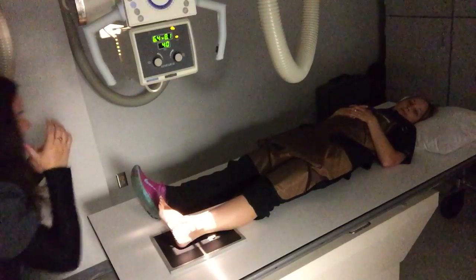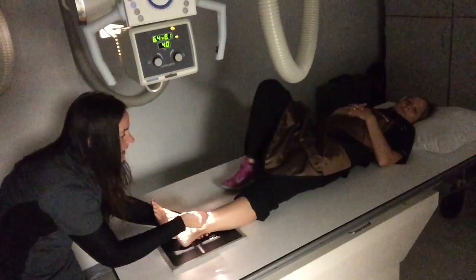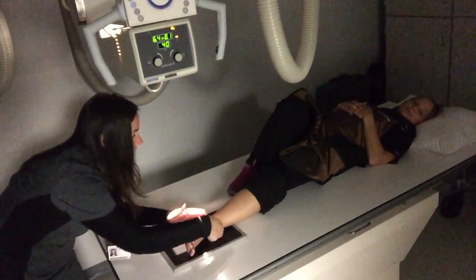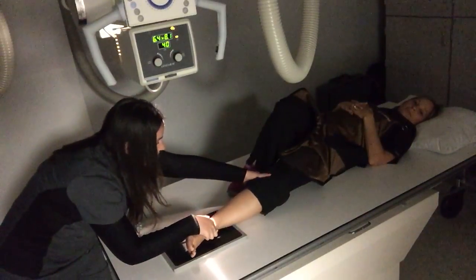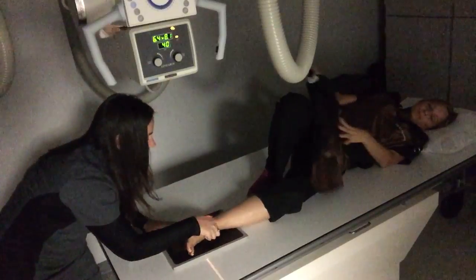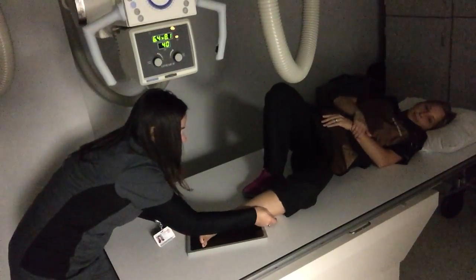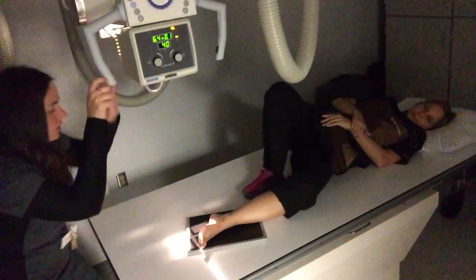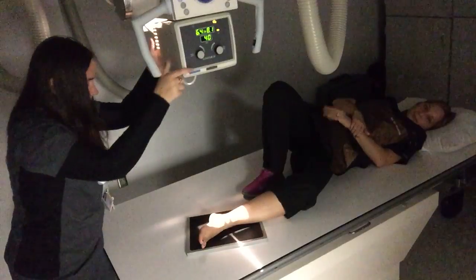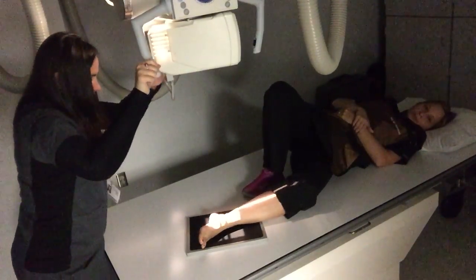And then the last view we have is the lateral view. This view, it's a medial-lateral, which means we're shooting from the medial side of her ankle through to the lateral. So I'm going to have her turn that direction. I'm going to bend her at the knee so that I really get her leg nice and lateral. And I'm going to scoop this cassette up under her to keep her right in the middle. For all these, we're maintaining our 40-inch SID. For this one, I'm going to be centering right over her medial malleolus.